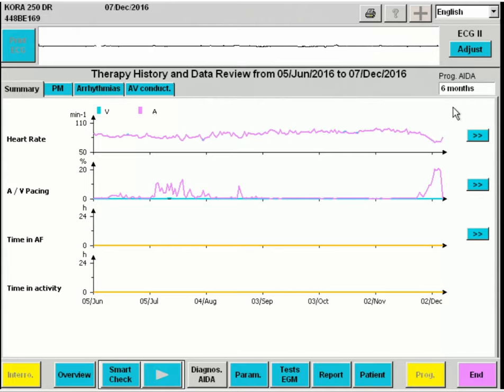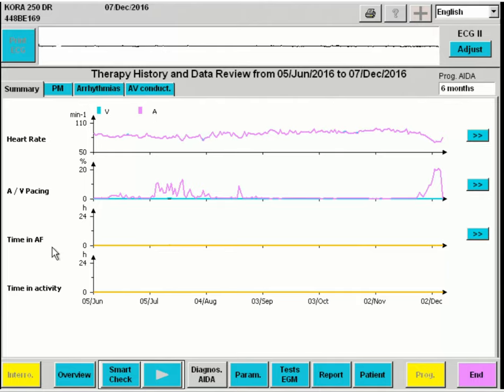Here we can evaluate a summary of measurements taken over the past six months: heart rate, A and V pacing percentages, time in AF, and time in activity.